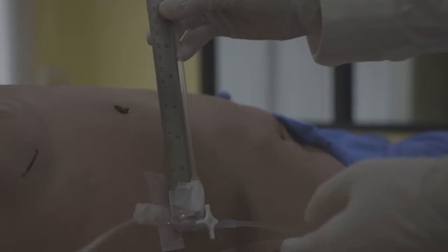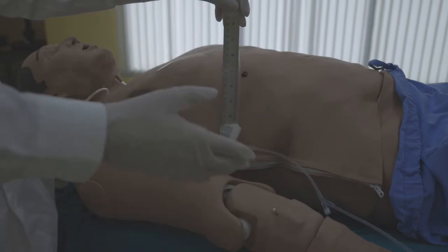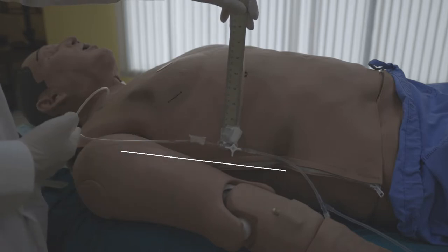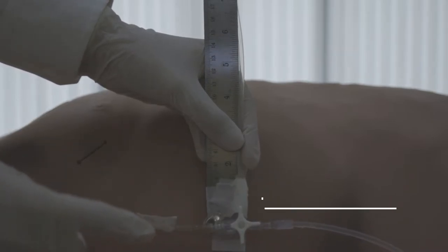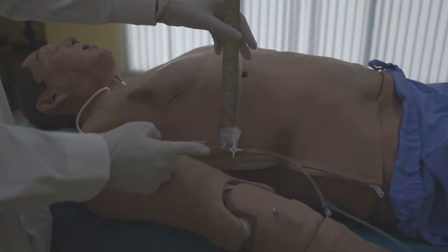Once we locate the landmark, we'll put our instrument on the set zero position. Then the fluids from the fluid bag will go from the IV lines into the central lines. Once you want to measure the CVP, you just turn the three-way valve to let the fluids from the fluid bag flush into the extension tubes.